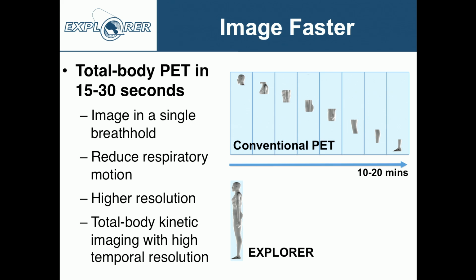So that's very interesting because it means for the first time we could do total body PET imaging in a single breath hold. Basically, the patient would just go in the scanner, 15 seconds later, we've got the same quality of data that it currently takes us 10 minutes to acquire. And if you can image in a single breath hold, of course, that's great.